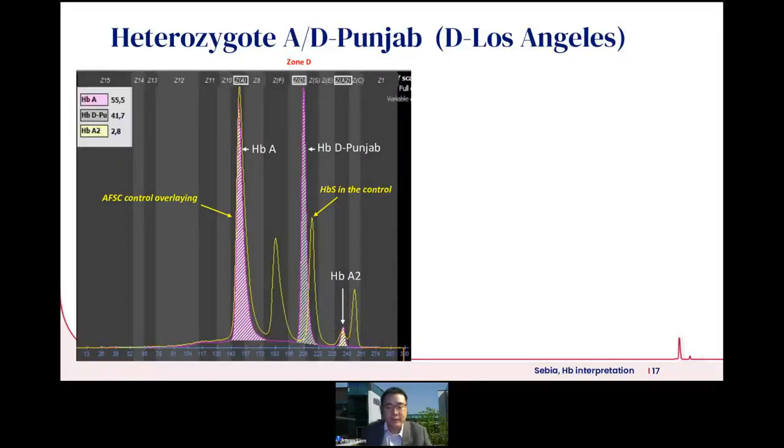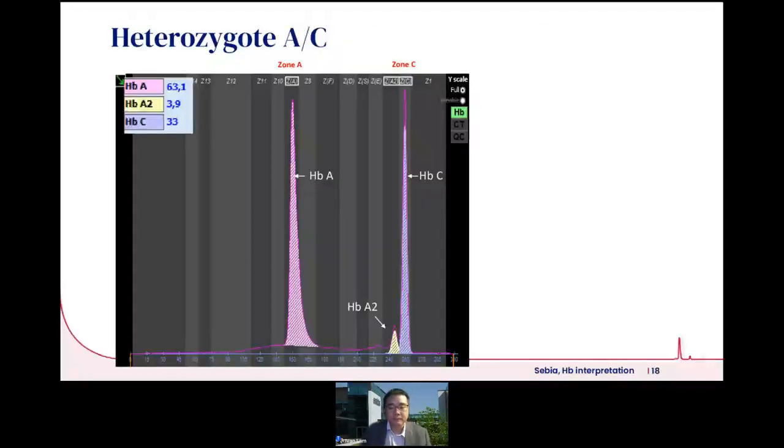So this is an example of heterozygous hemoglobin D. Although its position is rather near to the sickle cell, it occupies a different zone. In this example, it is overlaid with the control hemoglobin, so that you know the different positions of D and S. This is an example of heterozygous hemoglobin C. Characteristically, the variant hemoglobin is always on a lower percentage than hemoglobin A.